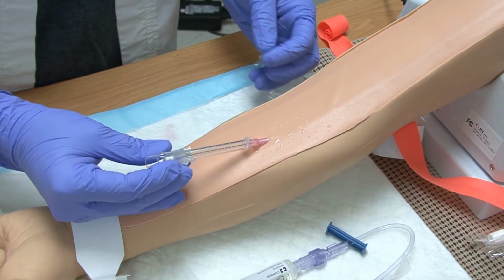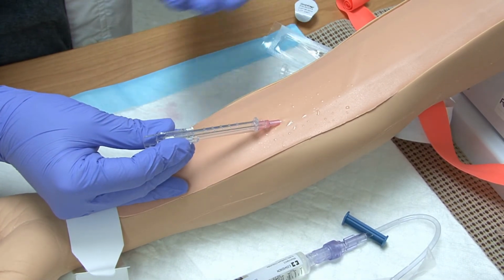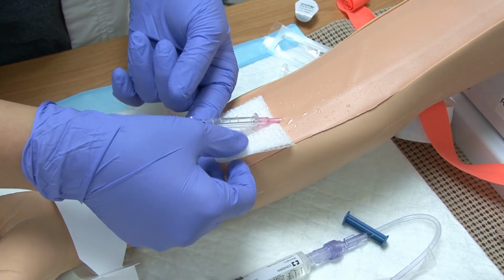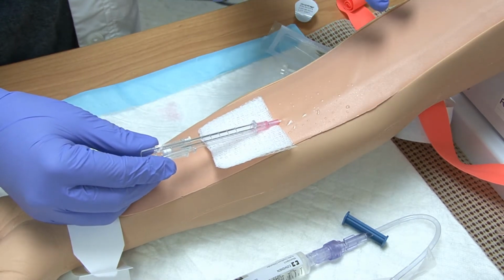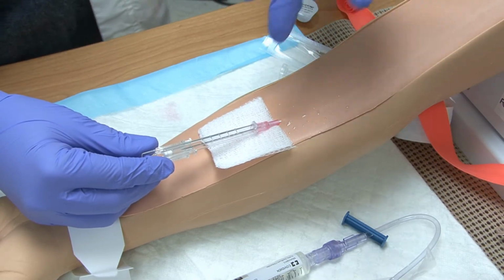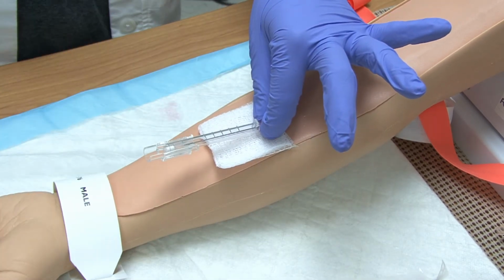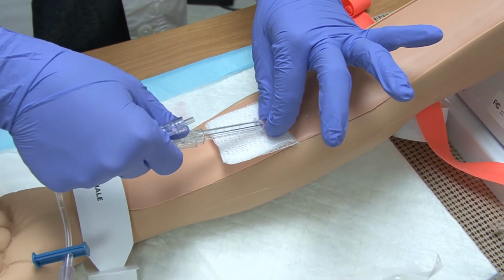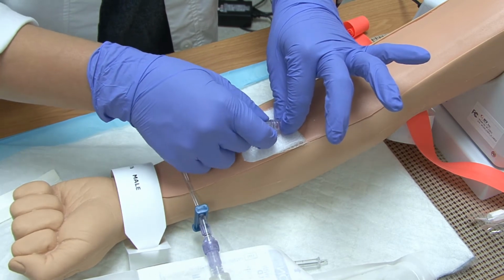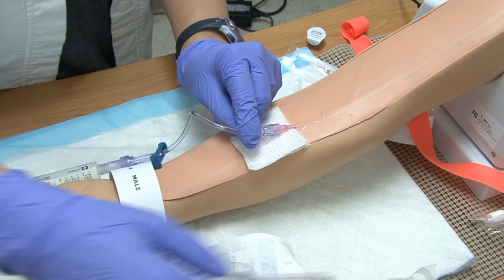At this point, I usually tell you guys to take a breath, because we're not in a hurry here. You're excited, you've got the needle in and everything. What you might want to do is get your gauze, and you can slip it right underneath here without touching your site up here. And when you do this, we're going to take this piece apart and now attach the extension set. So without touching my site, I have now stabilized the hub, which is the colored piece. I'm going to take this apart, and you may or may not see blood return at this point. You need to make sure and attach this. And once it is attached, you will see I never let go of my catheter while I'm doing my IV insertion.